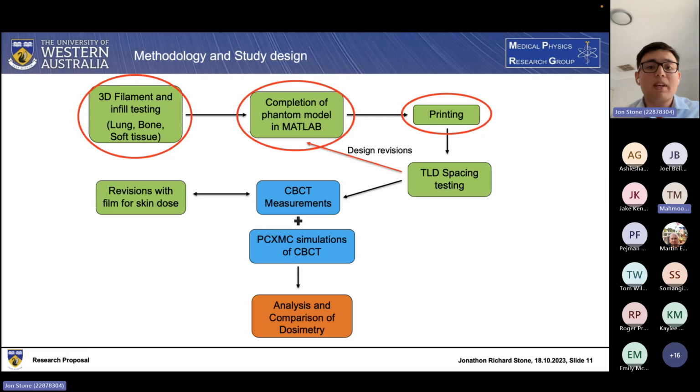So what you are building up is not exactly the composition that the human body contains. Yeah, so for context, PCXMC offers data tables with the different elemental compositions of the different tissues: infant soft tissue, infant bone tissue, and lung tissue are the ones we're interested in.